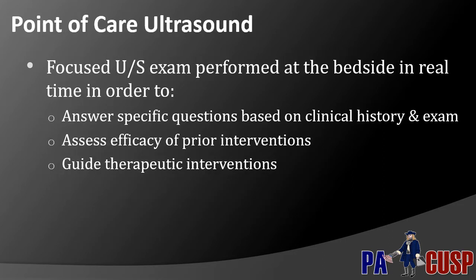Point-of-care ultrasound is a focused ultrasound examination performed at the bedside in real time. The main objectives are to answer specific clinical questions based off of a history and physical exam that you've obtained. It helps to assess the efficacy of prior interventions or to guide therapeutic interventions from the start.